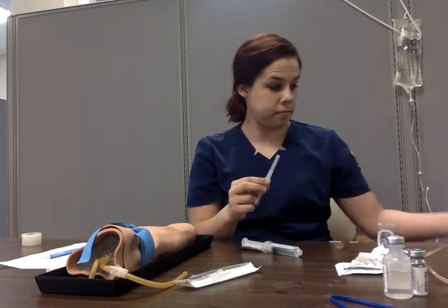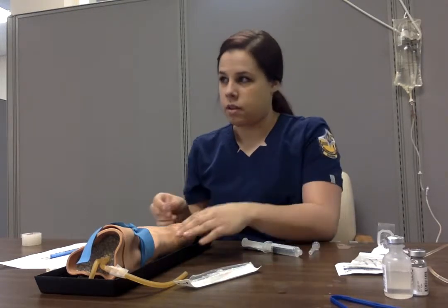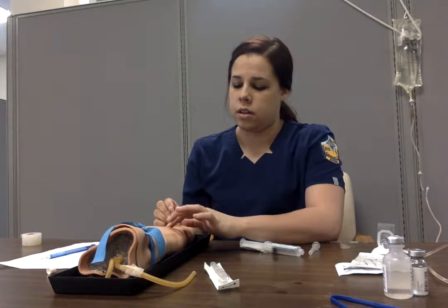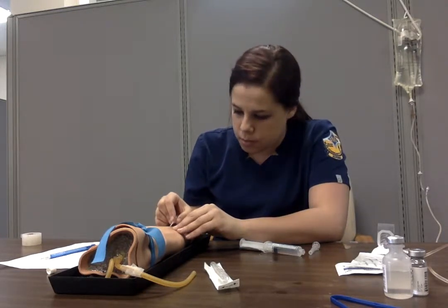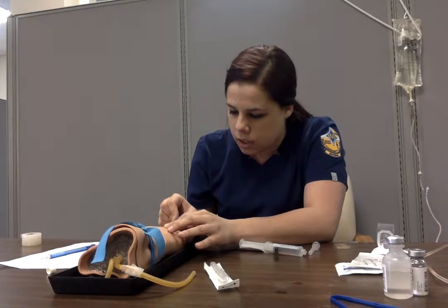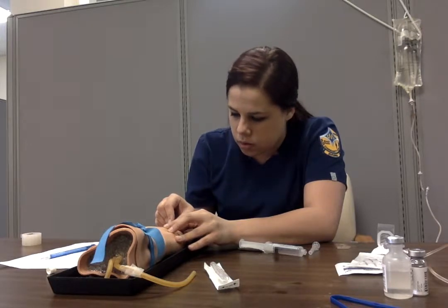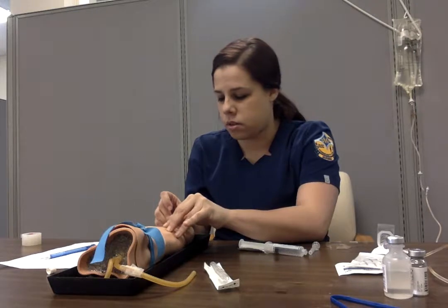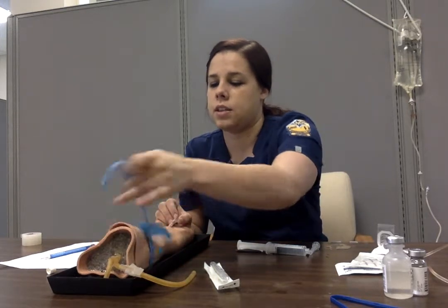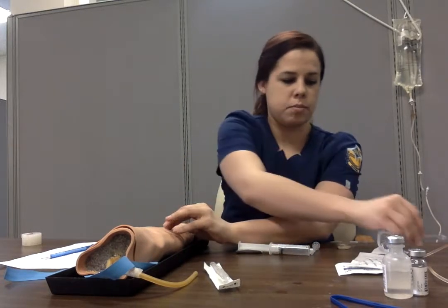I would have gloves on, and I'm using a 20 gauge needle. So I would have the bevel up, and I'd feel for the vein. And I found one. So I'm just going to insert, bevel up, pull the skin tight, insert, bevel up, and then even out. And take my needle out. And then I got flashback, so I'm going to take the tourniquet off. And I would throw this in the sharps.